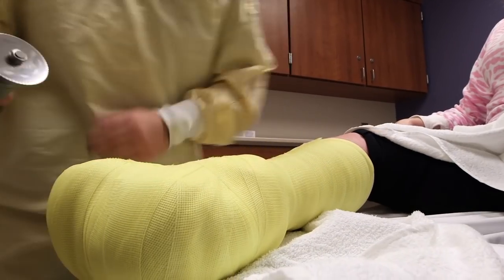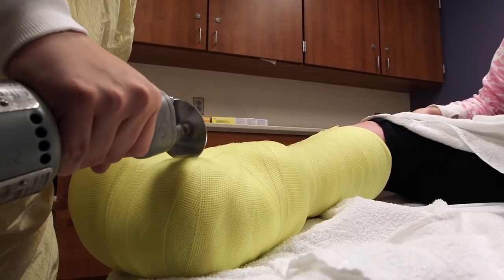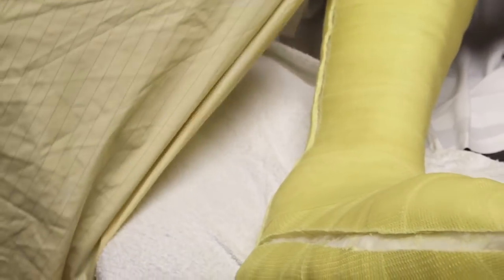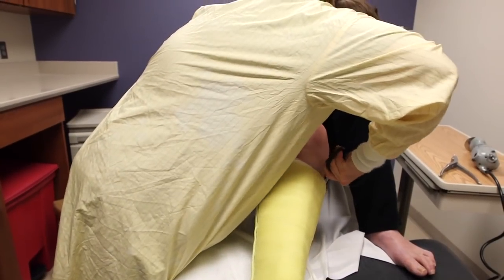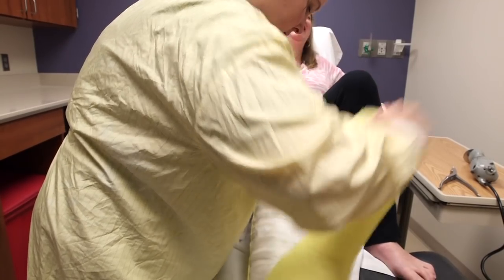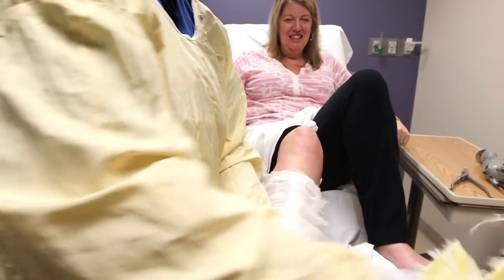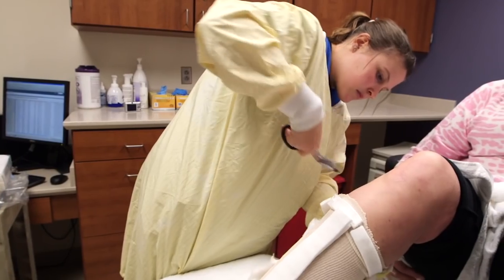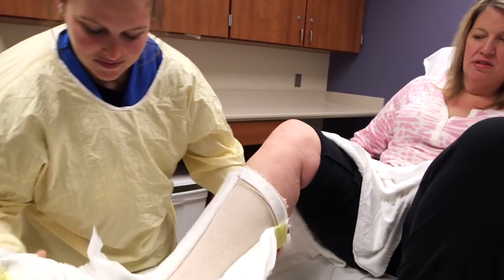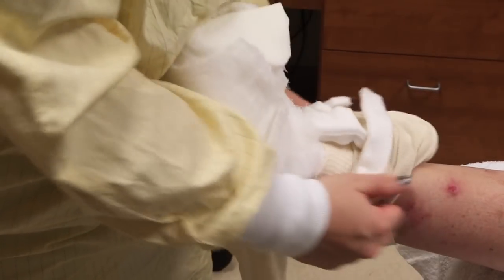Oh my god, I love these people. The results are pretty dramatic. Most of our patients are healing somewhere in the range of 30 to 40 percent in the very first cast, and those are results they haven't seen before. It is by far the gold standard of medicine for healing a diabetic foot wound. We should all be doing it, but most places don't — they're time-consuming and hard to put on, and you have to have somebody who's really comfortable putting on a custom total contact cast and able to handle not just the average wound, but the wounds that have been giving people such fits for so long.